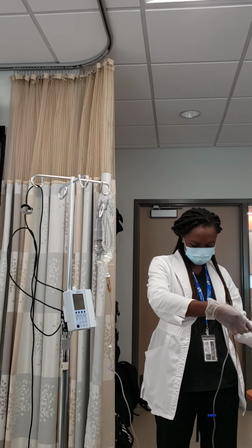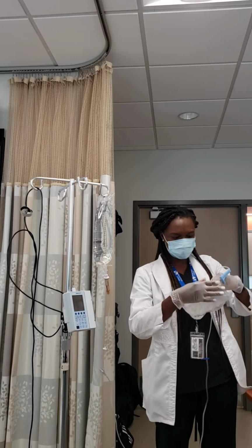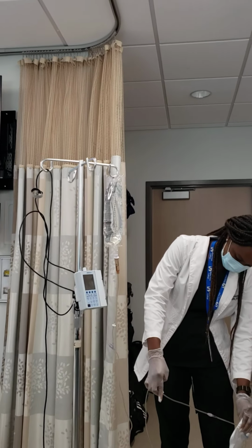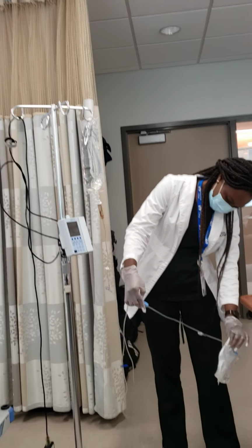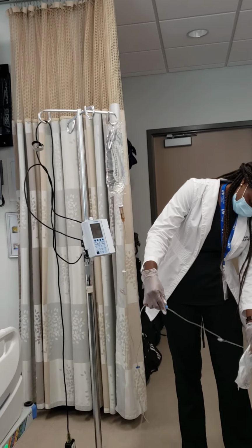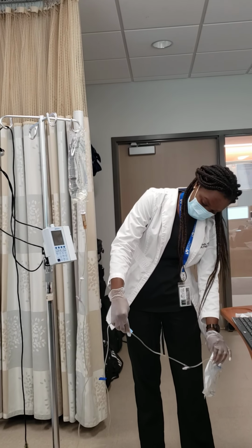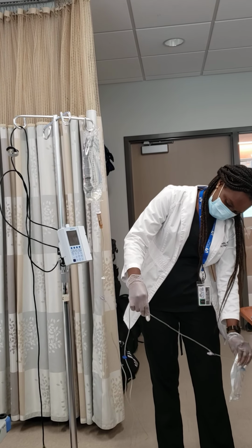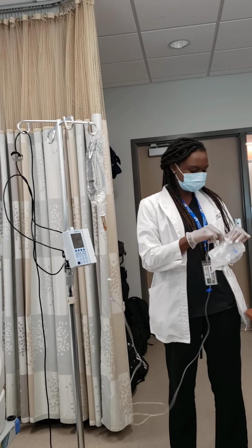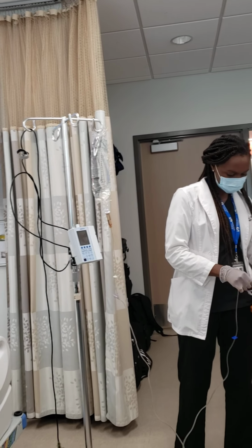You just have to make sure that that's clear. It's coming. It's dripping, that I do know. Yeah, so this is fine. But just make sure for test purposes that there are no air bubbles, right?